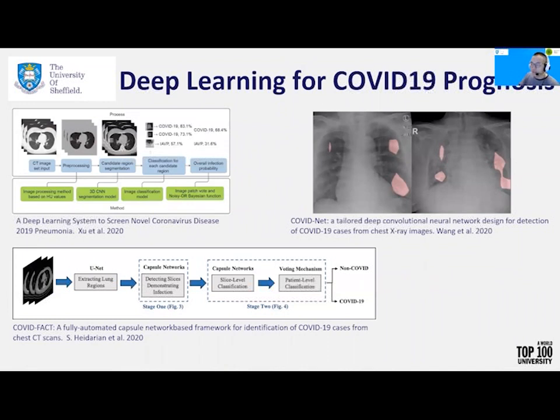Recently, there has been a number of studies demonstrating that deep learning-based applications are helpful for physicians and radiologists to make more precise diagnosis. Therefore, considering the continuous impact of the COVID-19 global pandemic, it is imperative to develop an AI screening method to facilitate medical workers, thereby reducing their workload and helping with more precise diagnosis.